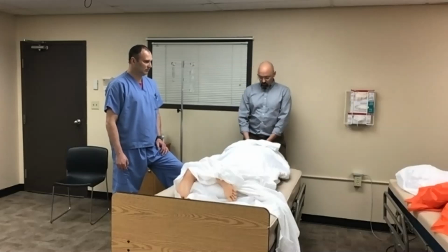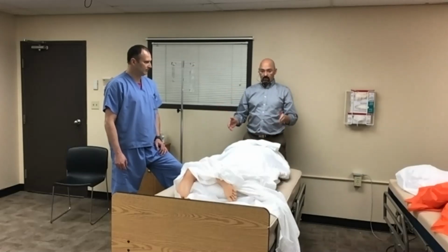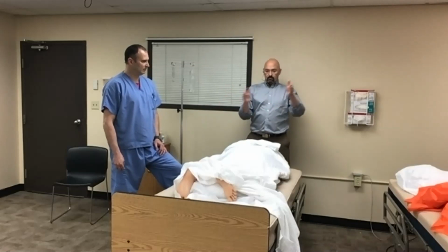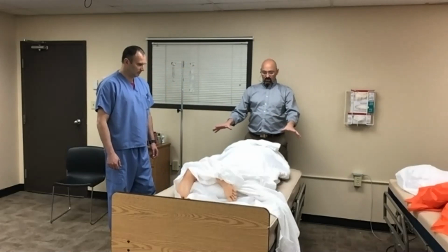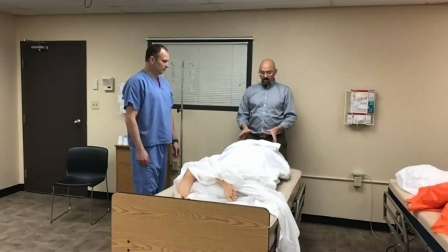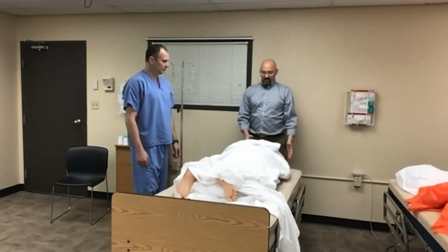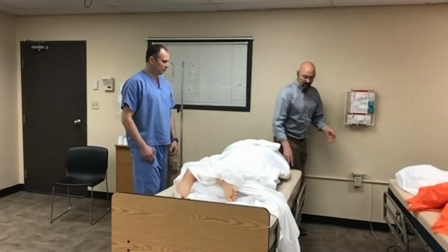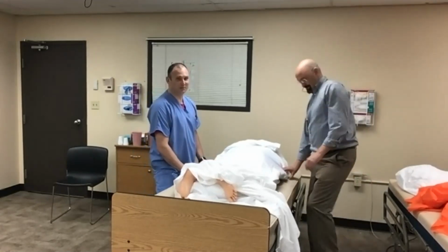So the person controlling the area, where I was standing doing 1, 2, 3, is the one asking, okay, does everybody understand what we're doing? Here's the plan, here's the process. We're going to fill it, check everything's clear, protect the patient. This person is calling the commands: 1, 2, 3, slide; 1, 2, 3, up; 1, 2, 3, turn. Same thing goes all the way through the process, because they're double checking your ET tubes, the airway, and everything else. And watch the wires so you don't trip over them.